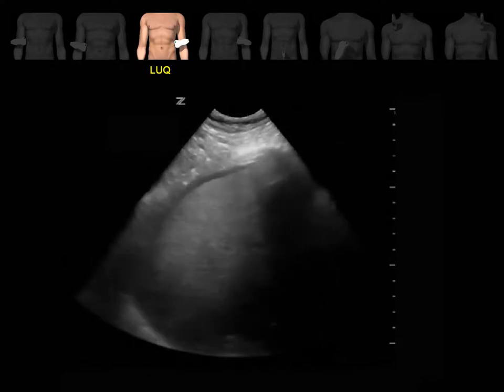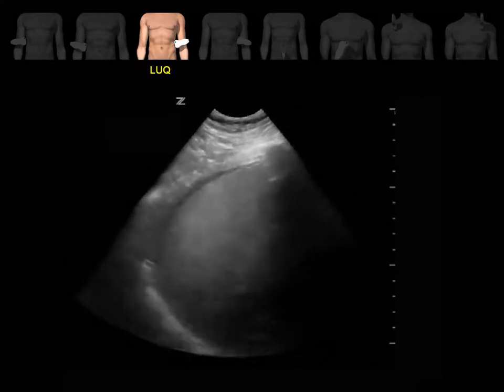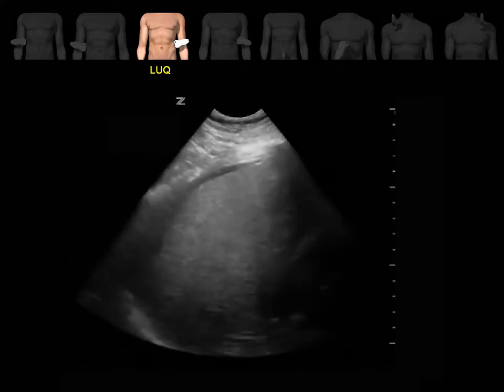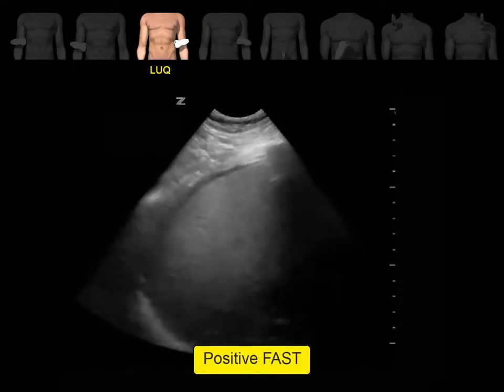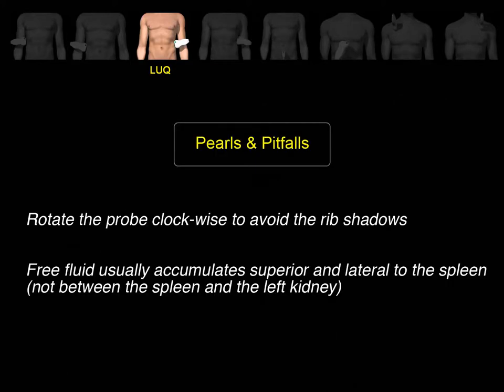In this clip, you can see free fluid between the spleen and the diaphragm — another example of a positive FAST exam. The probe may be rotated slightly clockwise so it fits obliquely within the intercostal spaces. Free fluid usually accumulates superior and lateral to the spleen, not between the spleen and the left kidney.